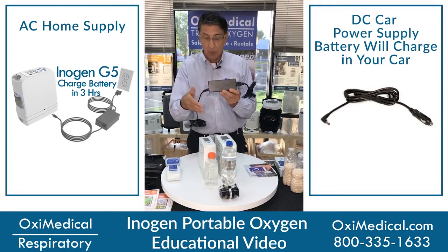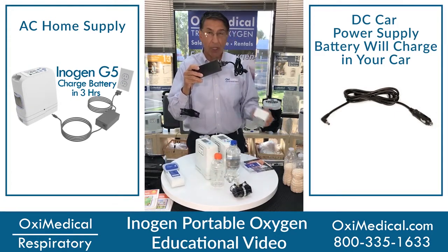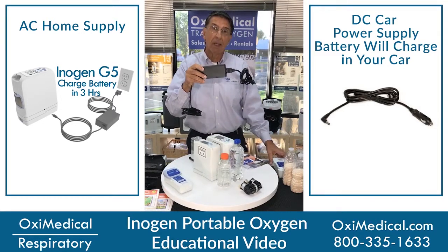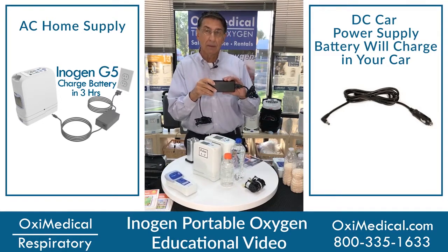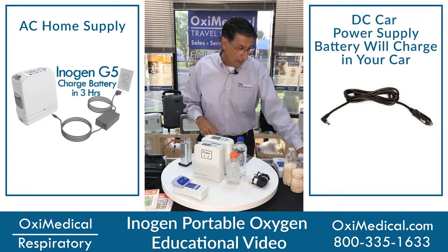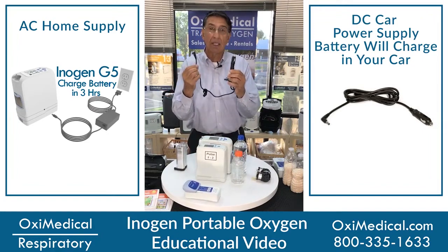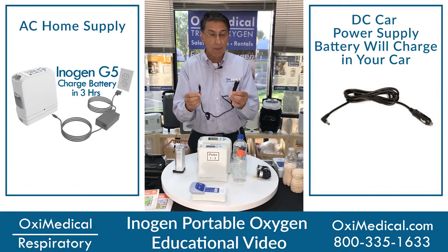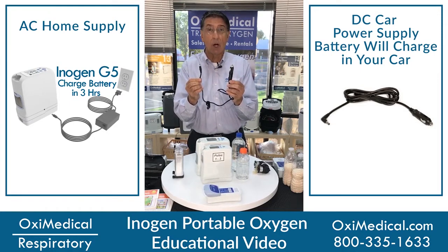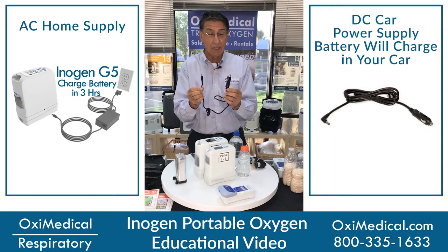If you want to reset your battery, just snap out the battery from the base of the machine, plug it into the wall outlet, it will reset itself, pop the battery back in, and you'll be able to use your product after it's reset. You can do the same thing in your car with a DC power supply. Again, I recommend always plugging this into your car outlet so you'll have endless oxygen for the road ahead.